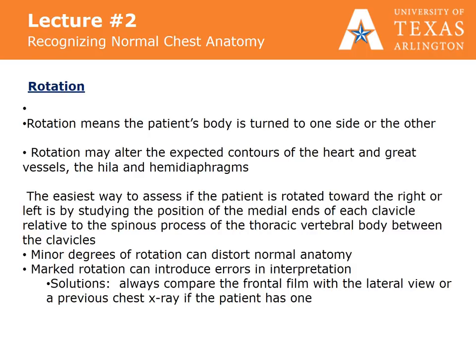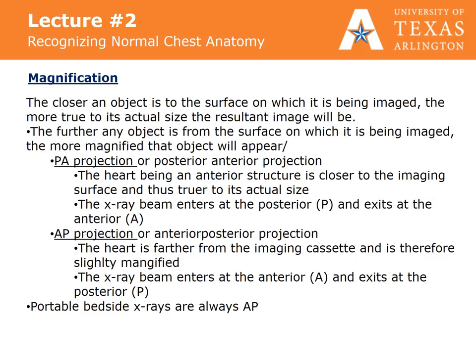A solution is to always compare the frontal film with the lateral view or a previous chest x-ray if the patient has one. The closer an image is to the surface on which it is being imaged, the more true to its actual size in the resultant image. Conversely, the further any object is from the surface on which it is being imaged, the more magnified that object will appear. In a posterior-anterior (PA) projection, the heart being an anterior structure is closer to the imaging surface and thus is truer to its actual size. In an AP projection, the heart is farther from the imaging cassette and is therefore slightly magnified. A good example of this is a portable bedside x-ray.